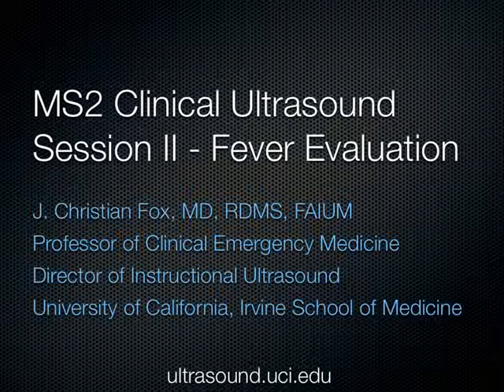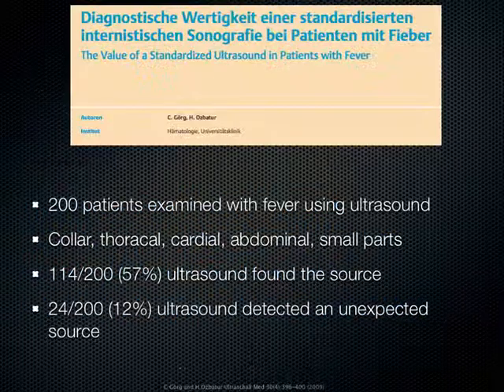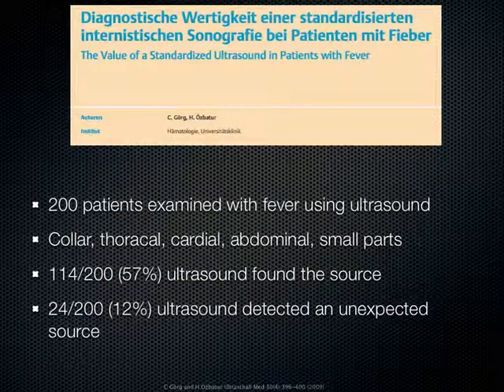This time we're going to be talking about fever evaluation, and we're trying to coordinate the ultrasound curriculum as close as we can with your other curriculum. Since right now you guys are focused on fevers and infections, I thought I would go through the approach to a patient who has a fever using ultrasound. I found an article on this, and it's in German, but it's kind of interesting.